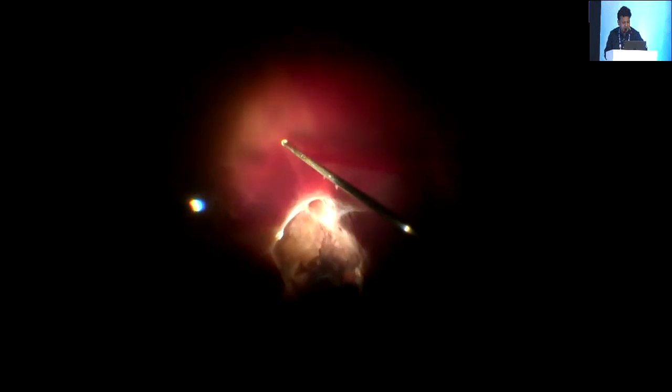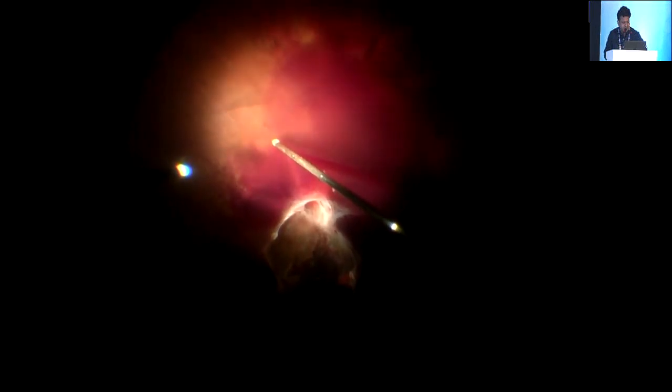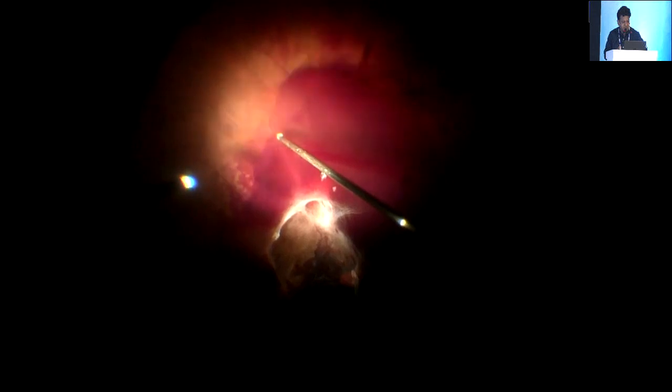Sometimes you will have subhyaloid hemorrhages, and the trick is to just make a small hole posteriorly, and through this small hole you try to remove all possible hemorrhage. Because if you make a larger hole here, the whole of this blood will come into the vitreous cavity and will impede your view, and you'll have to spend a lot of time clearing the media after this. So through a small hole, remove all this blood, and then you proceed ahead with your surgery.